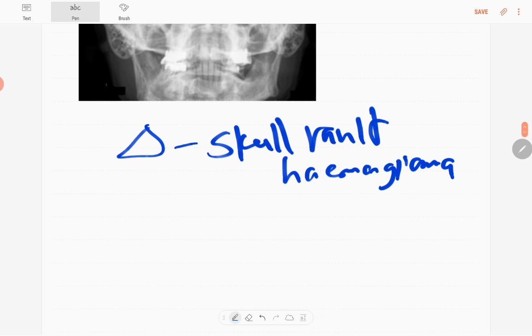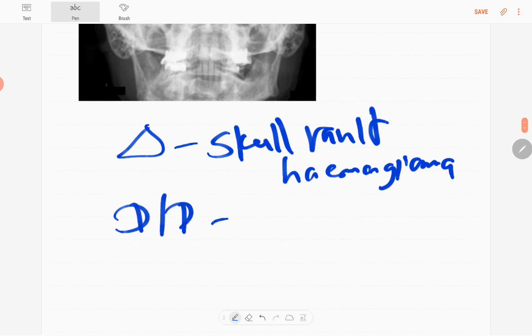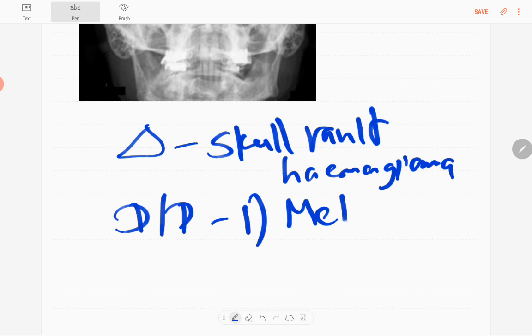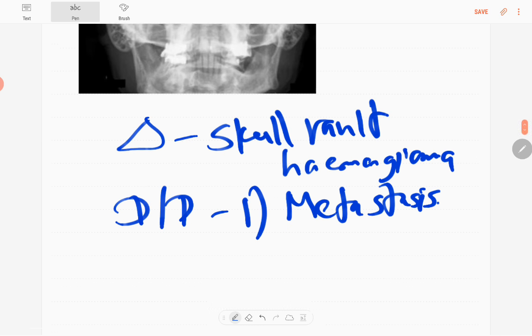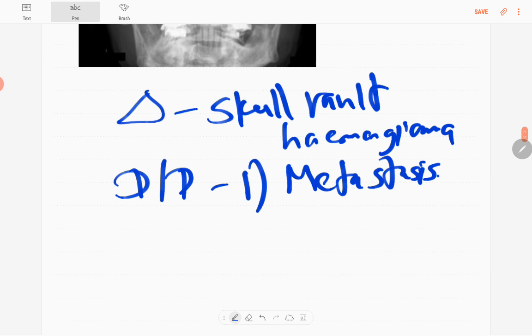The differential diagnosis: since this is an old patient, 55 years old, you have to exclude metastasis deposit, solitary metastasis deposit. It is a possibility. The other one is plasmacytoma.